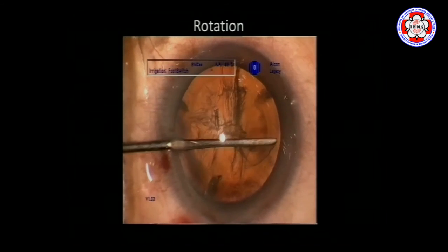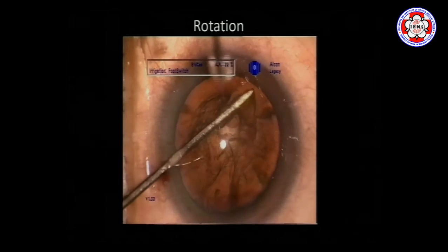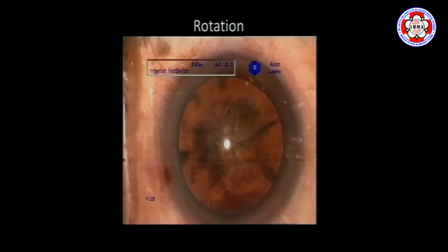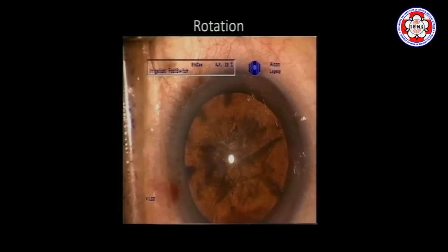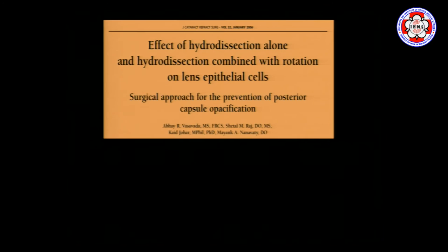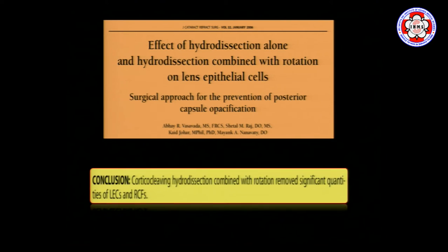The next important step is rotating the lens, because only when the lens is free and mobile can chopping and division maneuvers be easy. Initially we used a blunt spatula to rotate and confirm free mobility. A study by us compared hydrodissection alone versus hydrodissection combined with rotation, looking at how many lens epithelial cells were cleared. It clearly shows that if you dissect and rotate, you can remove a significant amount of equatorial lens epithelial cells — the cells that eventually cause PCO development.